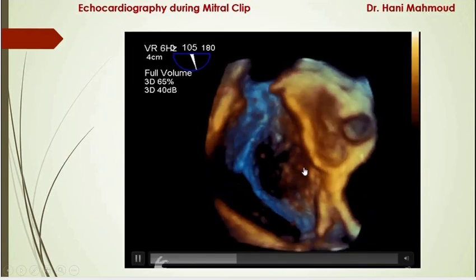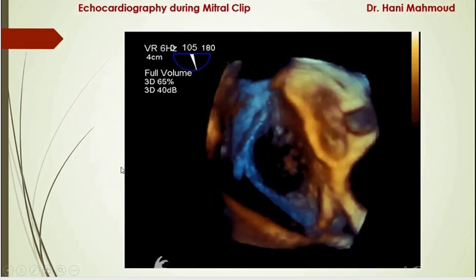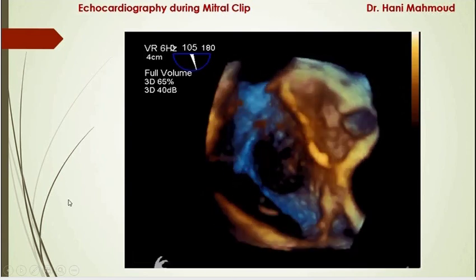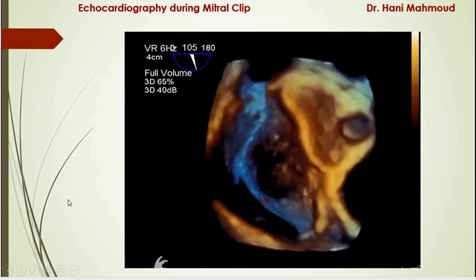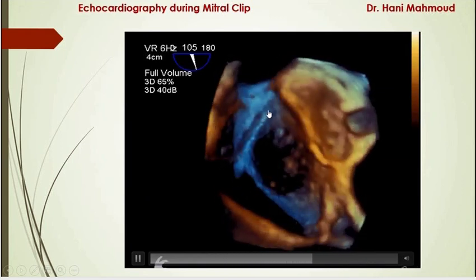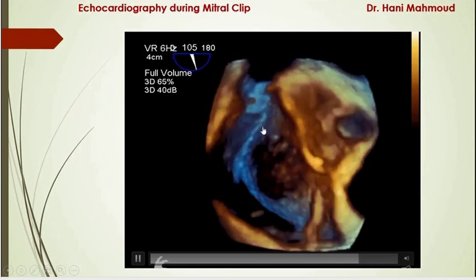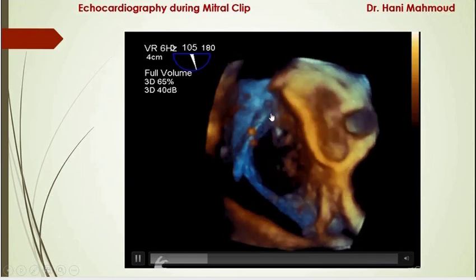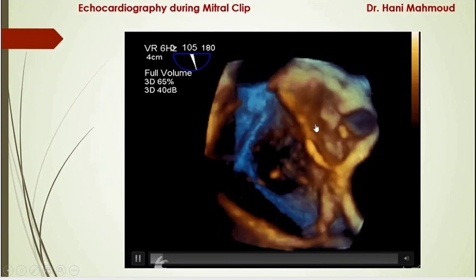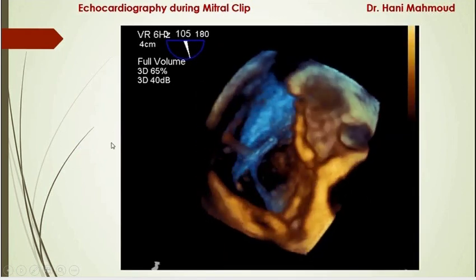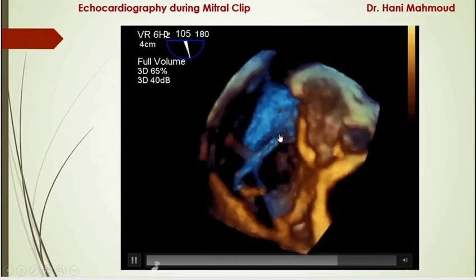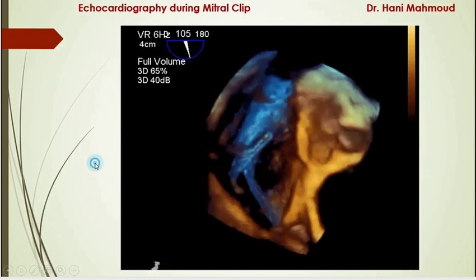Here you can see this dropout — I made it intentionally by lowering the gain to differentiate between the thin membranous part of the intra-atrial septum and the thick part. We need to puncture at the thin part, avoiding the thick part. This is the catheter coming from the inferior vena cava towards the superior vena cava. I showed the catheter tip to the interventionist and told him to come more inferiorly, avoiding going anteriorly toward the aortic valve. He came down but pointed anteriorly, so I told him to rotate clockwise to face a little bit posteriorly, and it was a good position.